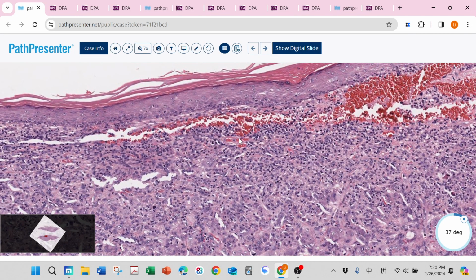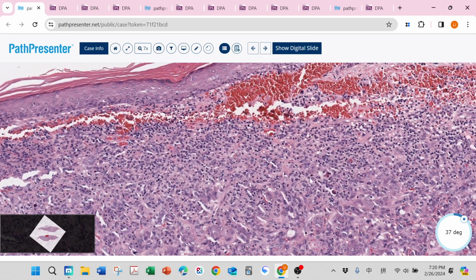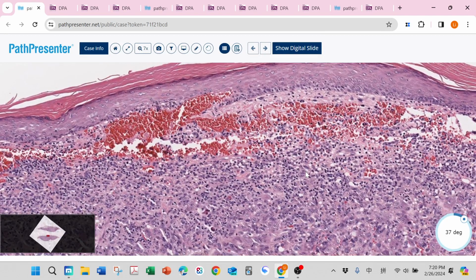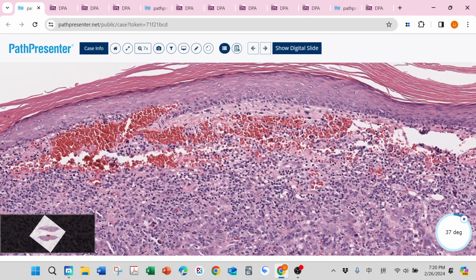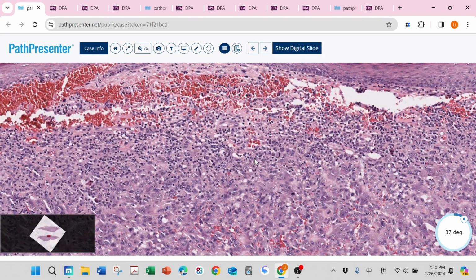S stands for squamous cell carcinoma, especially spindle cell looking; that should be high-grade spindle cell squamous cell carcinoma. L is leiomyosarcoma. And A is AFX, which is what this slide shows: atypical fibroxanthoma.